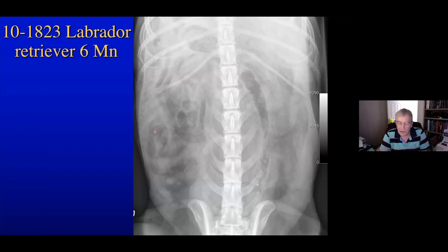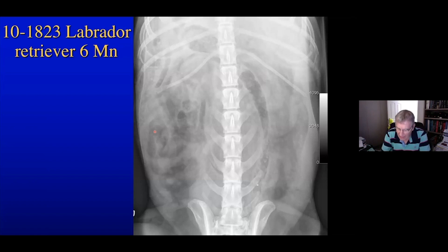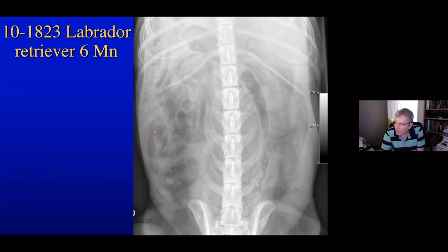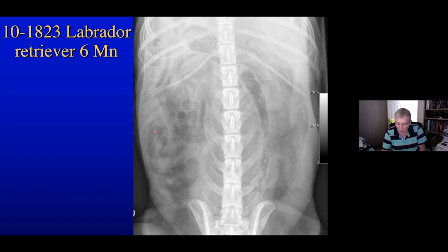And the ventrodorsal — we take the ventrodorsal because the animal is easier to position, and certainly the abdomen will spread out allowing us to visualize more organs than in a dorsoventral, where the abdomen tends to hang more underneath the lumbar spine.